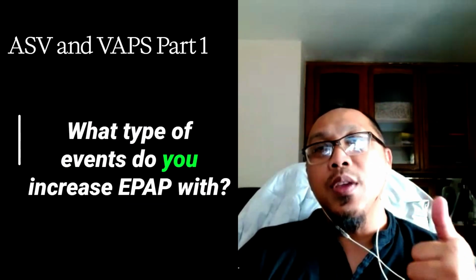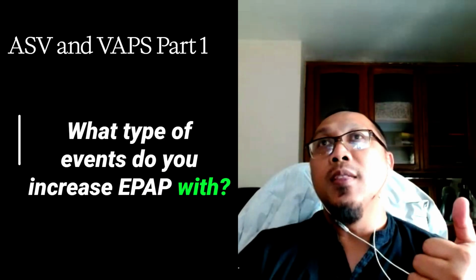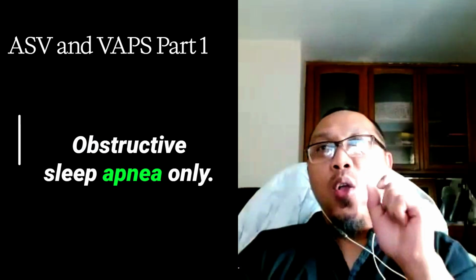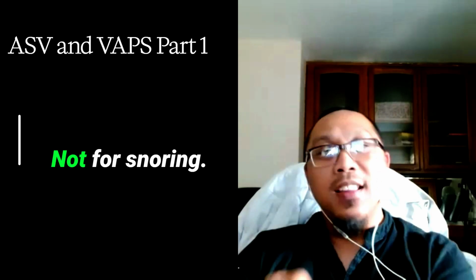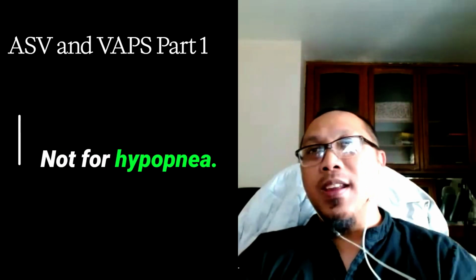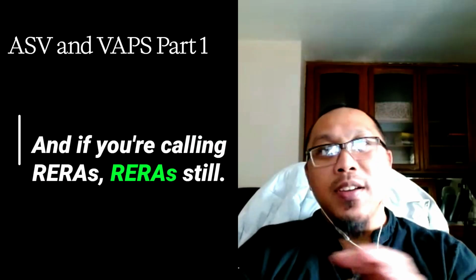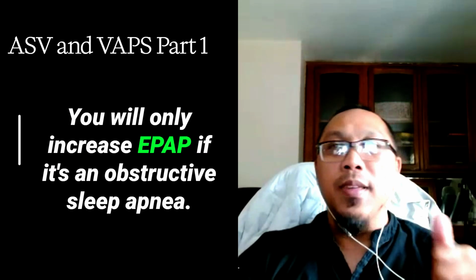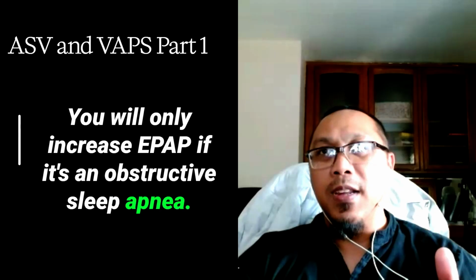What type of events do you increase EPAP with? Oh, yes, obstructive sleep apnea only. Not for snoring, not for desaturation, not for hypopneas. And if you're calling RERAs still, not for RERAs. You will only increase EPAP if it's an obstructive sleep apnea.